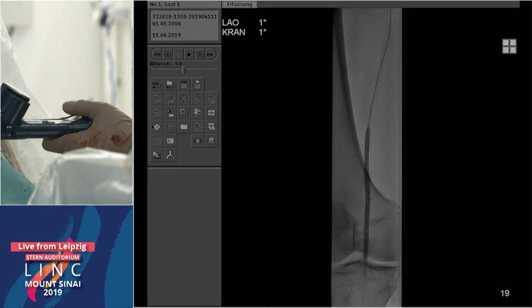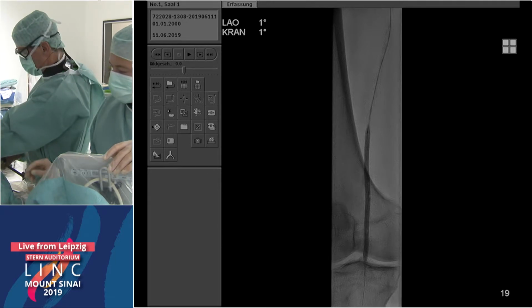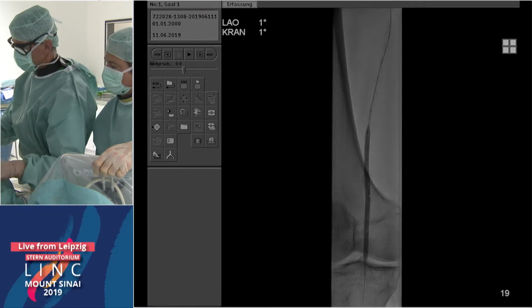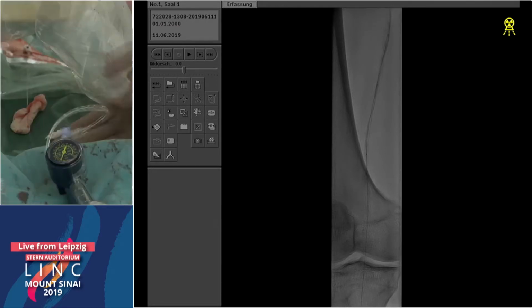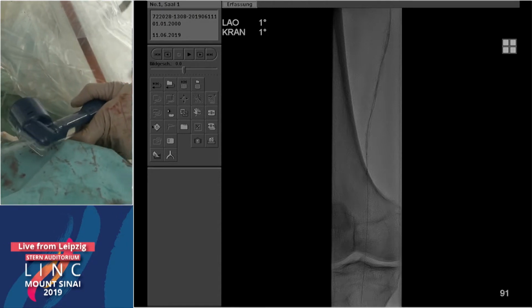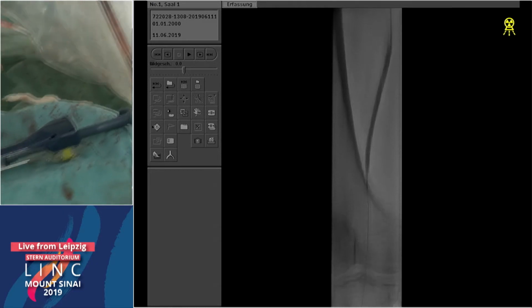I would say at the moment we have reasonable choices, but for instance, drug-eluting stents are not really reimbursed on top of everything, which I don't think is fair to the technology. Anyway, I think we need to make choices. Probably we cannot do everything in one procedure. But an approach like here with a scoring balloon and DCB is actually covered.